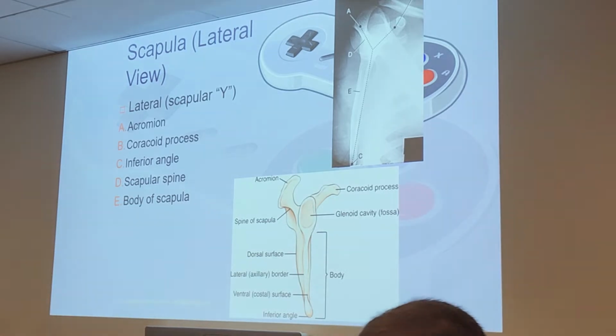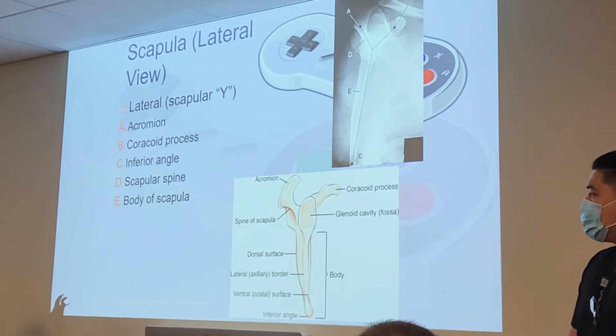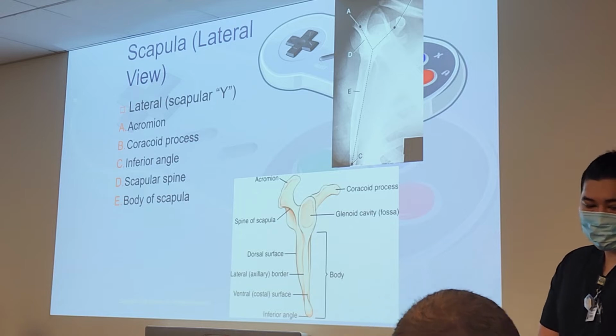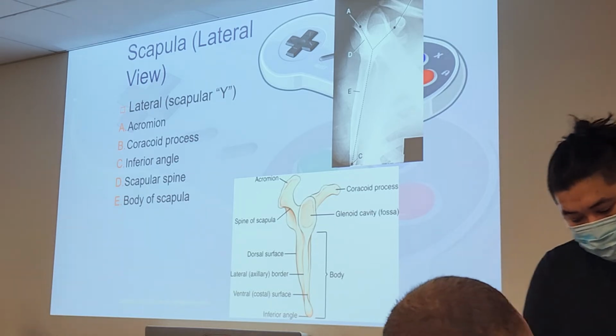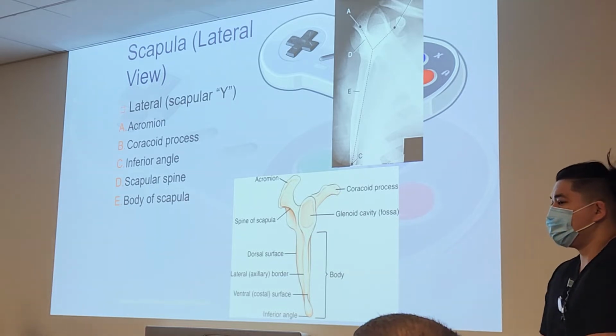So you can actually take your scapula and put it on its side like this, if it's on your table. You can see that nice little Y shape. It does make a very distinct Y shape. Some good profiles. You want to see that? You might do that? Do a little scapula.